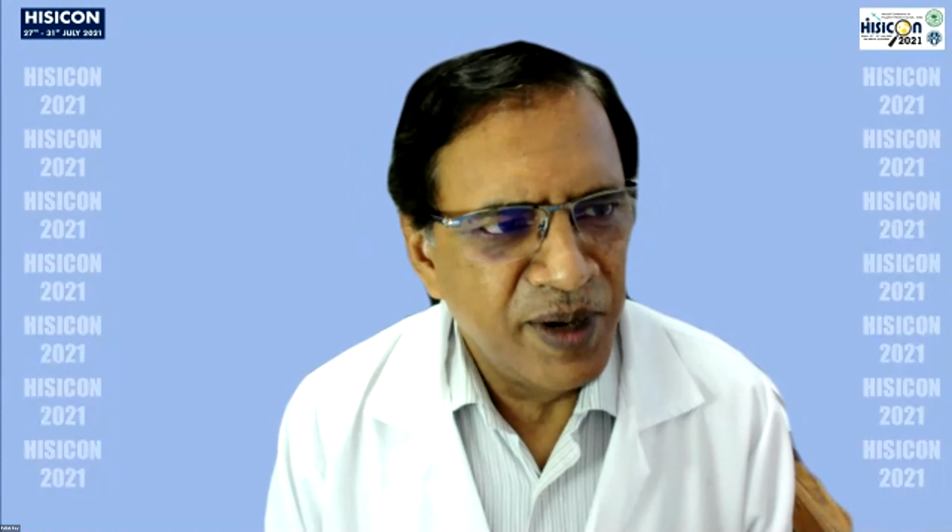Sir, there is no zone diameter interpretation in case of anaerobes. What is your view, sir? Yes. Truly speaking, for anaerobic organisms, the only method recommended by the world authorities is the agar dilution test and or broth dilution test. Therefore, disc diffusion tests don't work. Truly speaking, disc diffusion tests don't work in any organism which requires more than 24 hours to grow. For mycobacteria, many people have tried and couldn't really standardize it, even for rapidly growing mycobacteria.